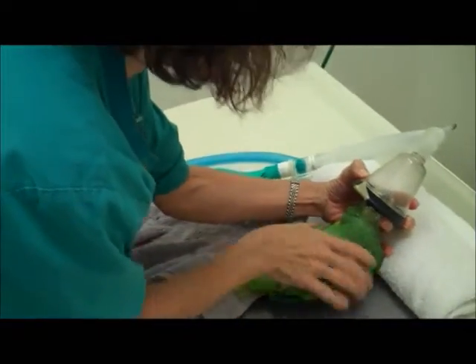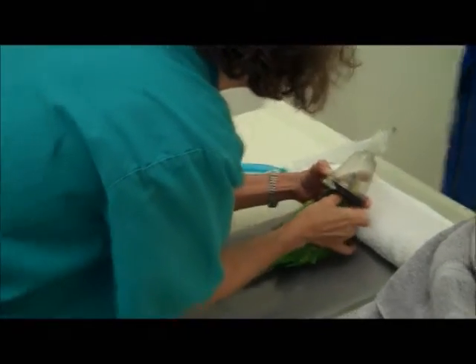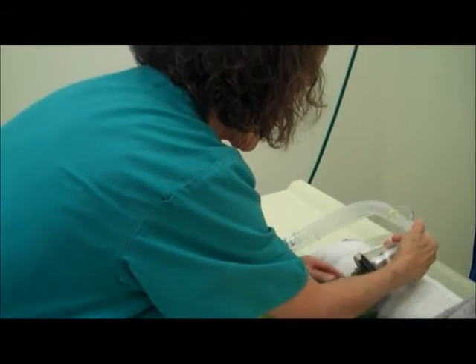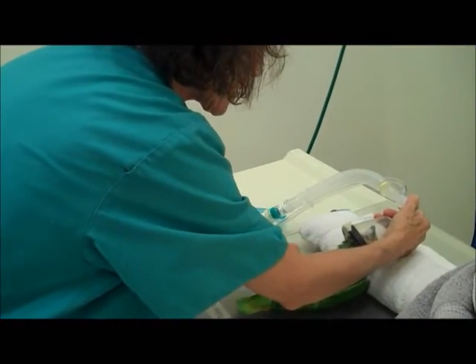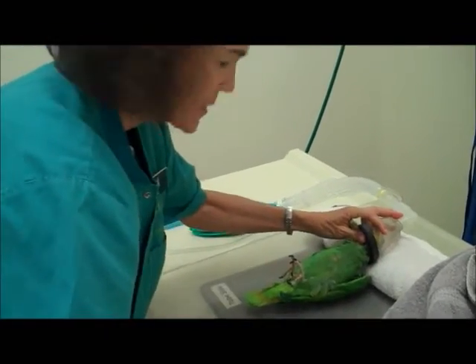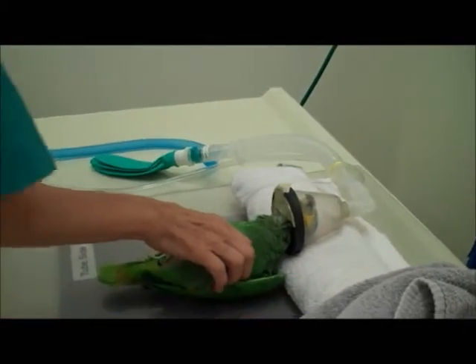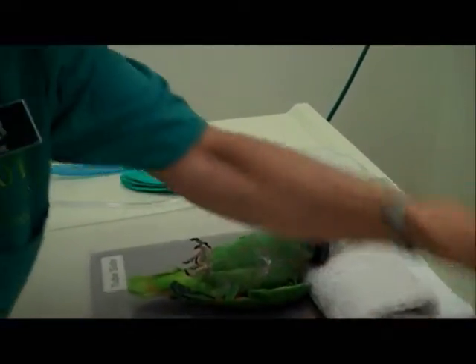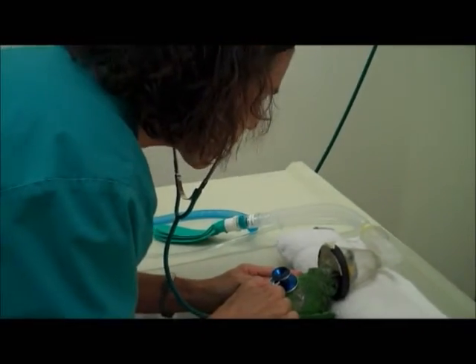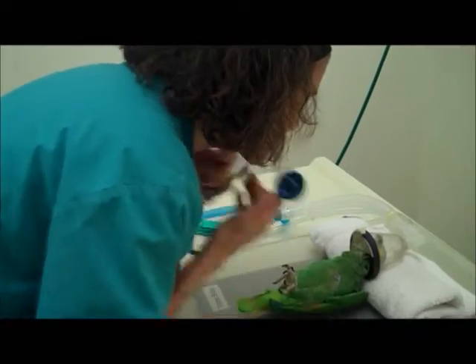I place him on the table, positioning him so that he is straight. A piece of tape to hold his little head in. I'm going to lower the anesthesia again. Heart rate is good. Respiration is not great.